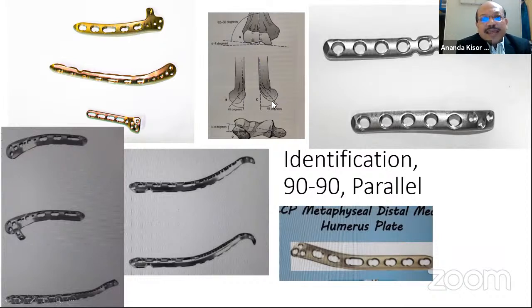The capitulum remains a little bit anterior, and the lateral condyle, lateral epicondyle, comes along with the capitulum. So in this type of plate, there is a lateral post. So if it can be placed, and the lateral side is completely straight, it is almost flat. So it is a dorsolateral plate, a posterior dorsolateral or posterolateral plate.